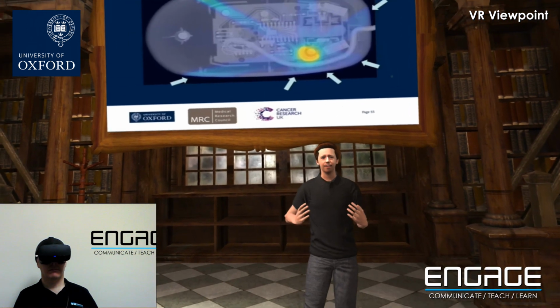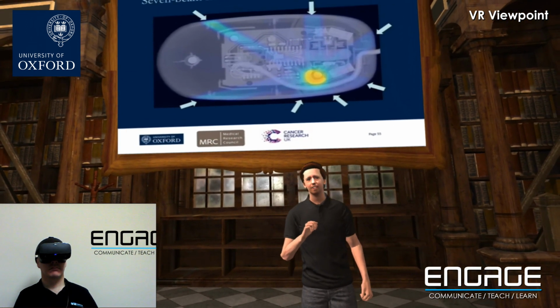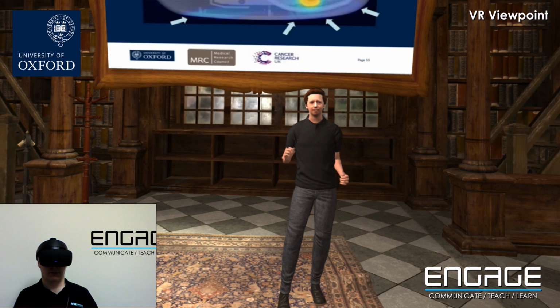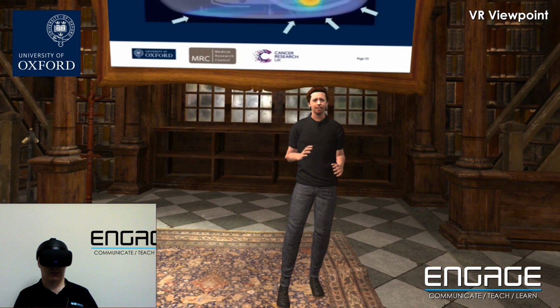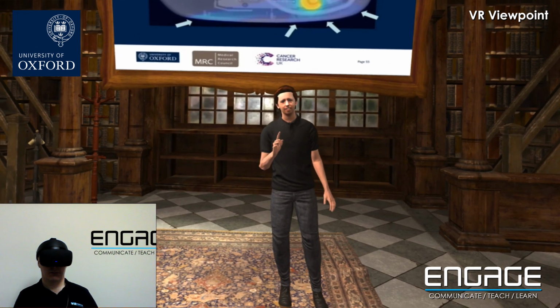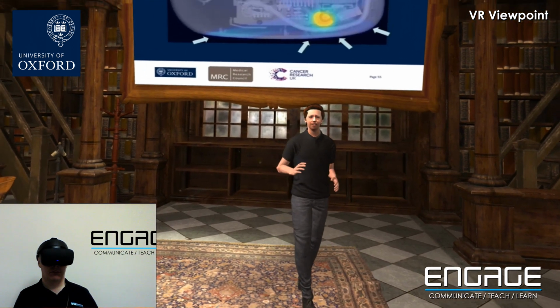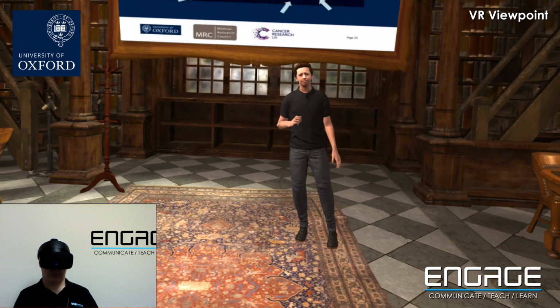So by using multiple beams, the physicists are able to overcome that problem that the peak dose from any one particular direction is not in the right place. By catching the tumor in the crossfire, the tumor's taking the brunt of all 7 beams. The rest of the tissue's only got to deal with 1. Remember, healthy tissue is pretty good at dealing with small doses of radiation. Tumors often have mutations and a busy lifestyle that means they're much less able to cope. So this should give a good result.